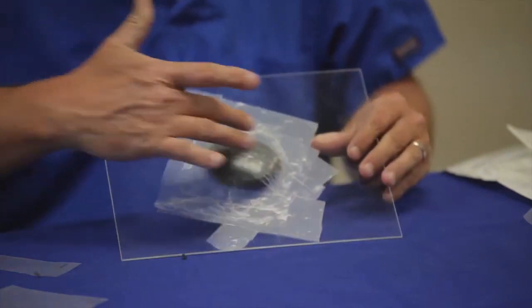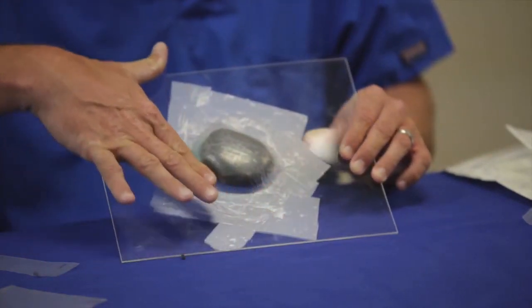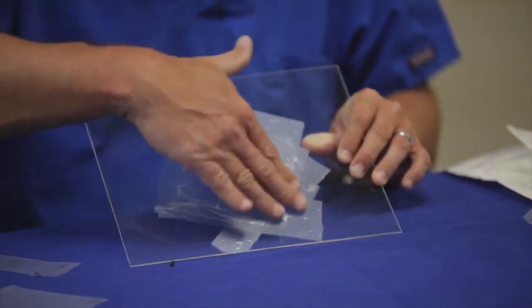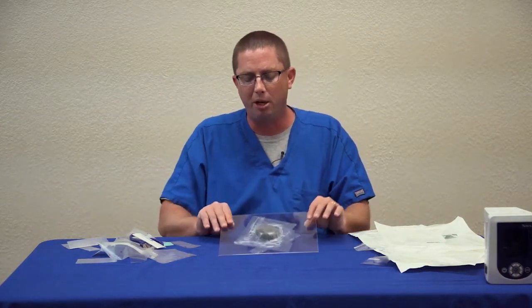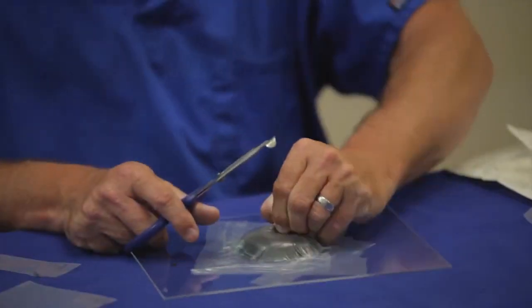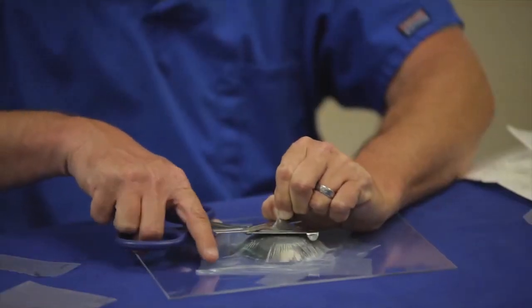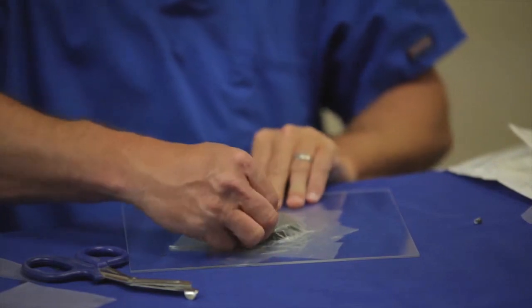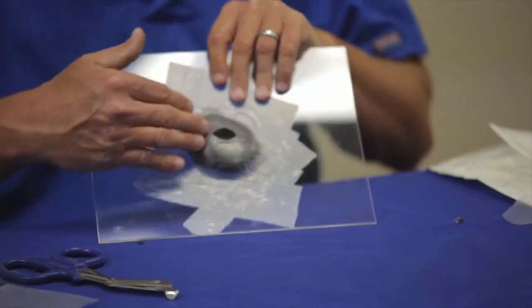Then after I have the drape applied, a good rule of thumb is to walk your finger around the outside of the drape to ensure that you have good adherence of the drape to the peri-wound area. From here, you lift and pinch the drape. So lift up, pinch, take your scissors, and you need to cut at least a dime-size hole. This is where the port pad is going to be applied to apply suction to that wound base.